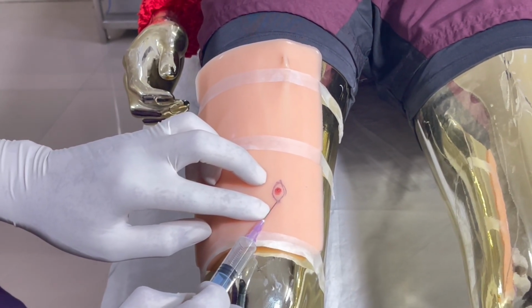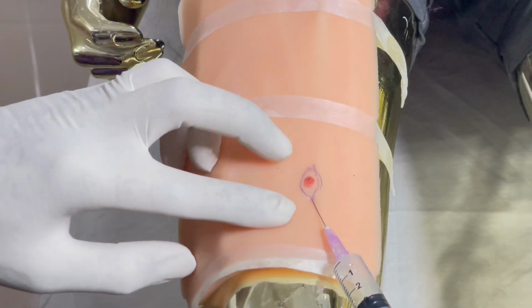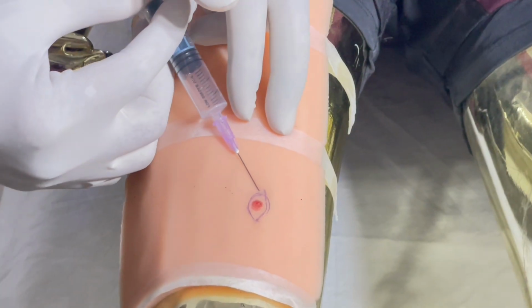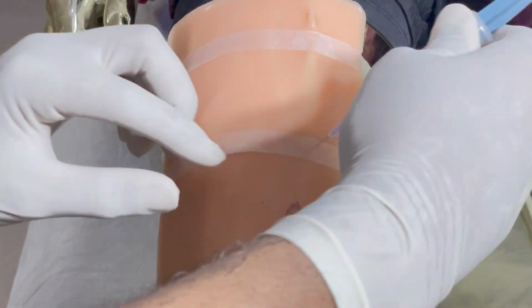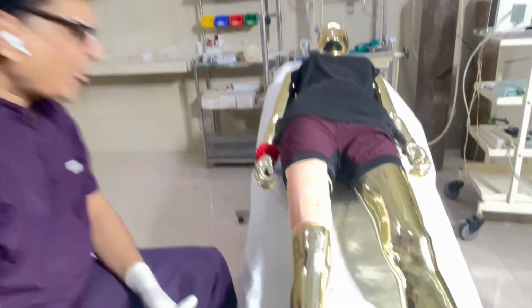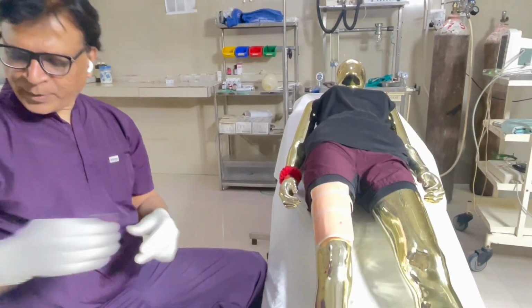Then I will put the local in all these directions, on this side. One more scratching pain. Okay, thank you. So this is another in this manner. Now I will be waiting for at least 5 minutes. Till then, this mole will be sent for histopathology.